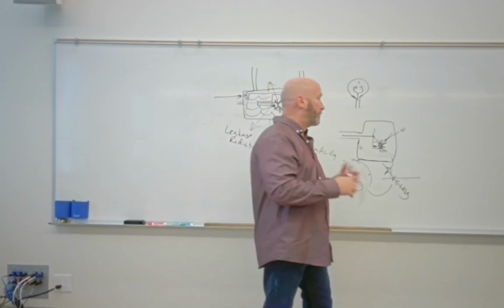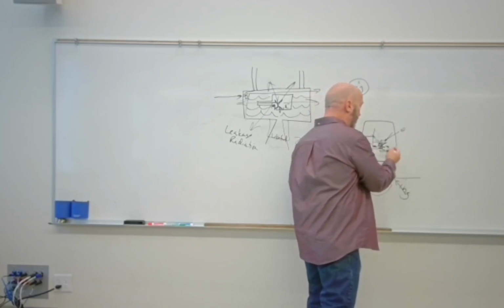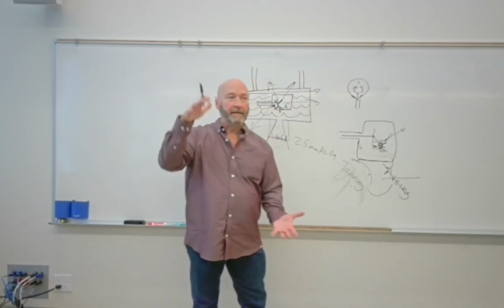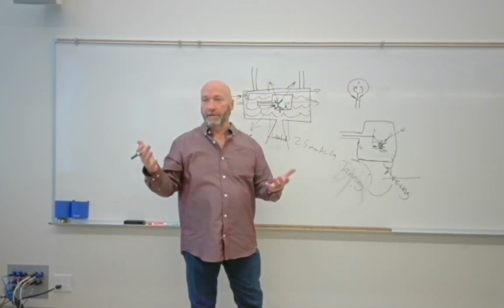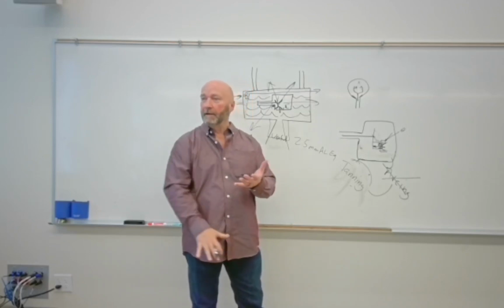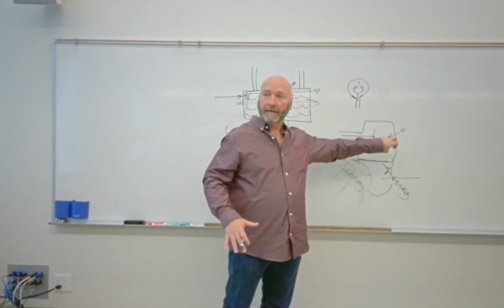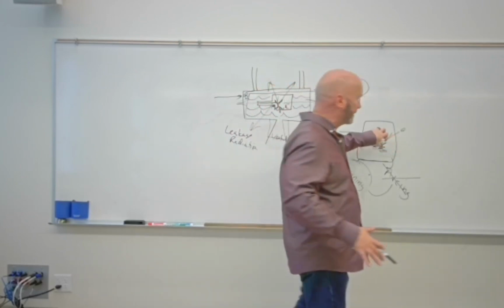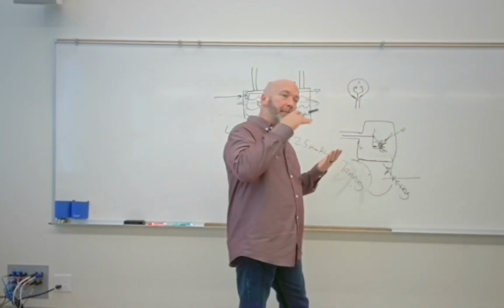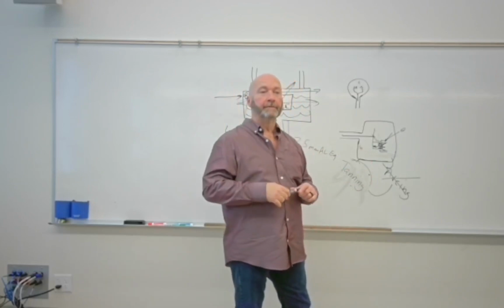Purpose for the function of the focusing cup is we apply negative charge to it. All those are negative too, and it's kind of like compressing leaves in a bag, right? It's just cramming the leaves together, to make it a tighter collection of electrons before we send them across the tube, so that they impact a smaller area on the anode and bring up sharpness, recorded detail.